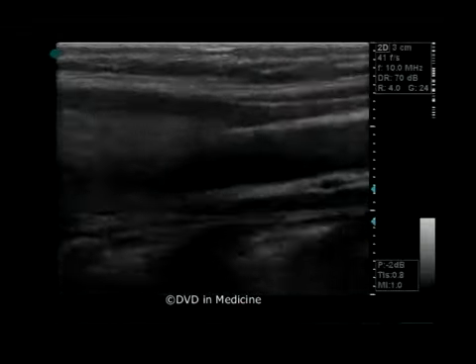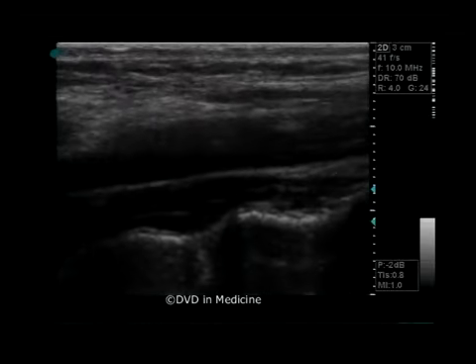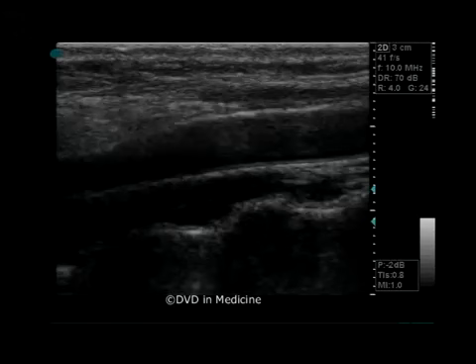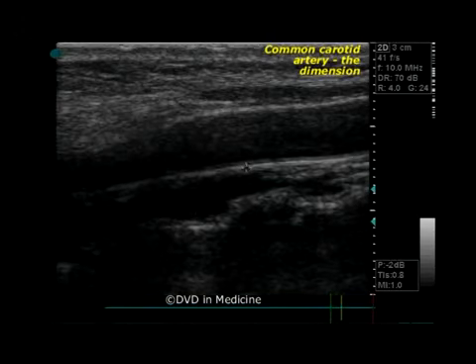One should also analyze the diameters of carotid arteries so as not to miss any possible aneurysms. In order to obtain a more accurate correlation between the ultrasound diameters and anatomical or surgical diameters, one should put calipers on the external outline of the artery.